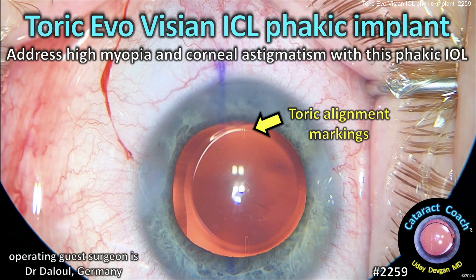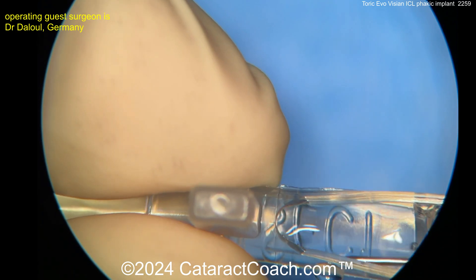CataractCoach.com. Toric Evo Visian ICL Phakic Implant. You can address high myopia and corneal astigmatism with this phakic lens.